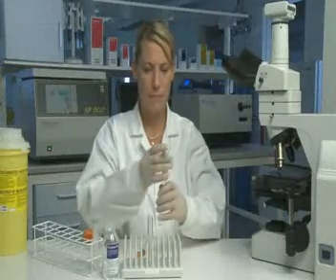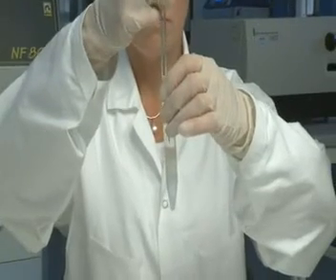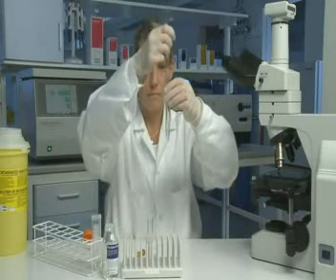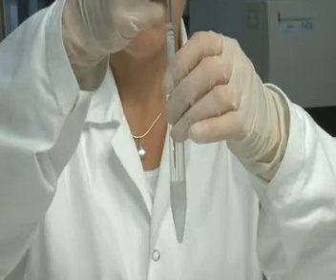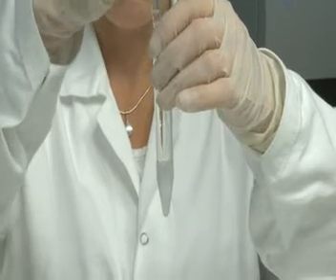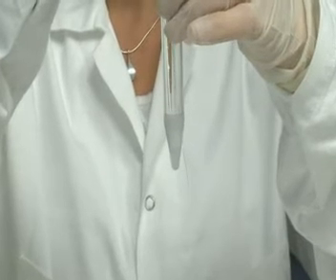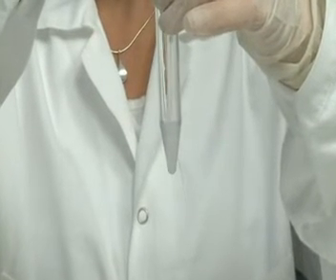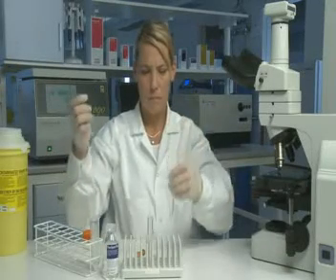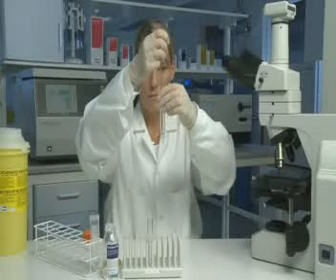With a Pasteur pipette, aspirate the PureSperm 40 and most of the PureSperm 80 using a circular movement, following the surface as it descends. Change to a new sterile Pasteur pipette, aspirate the pellet, and leave the rest of the PureSperm 80.